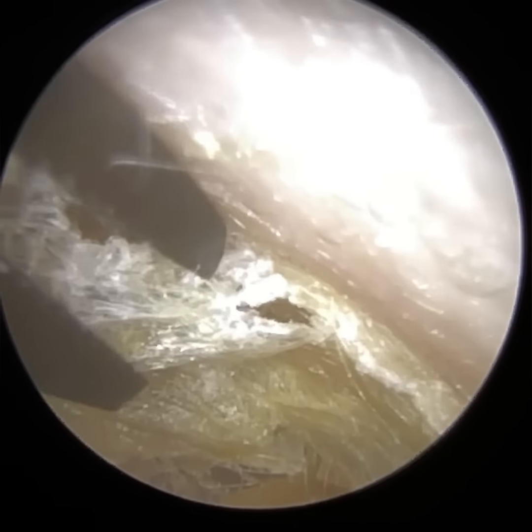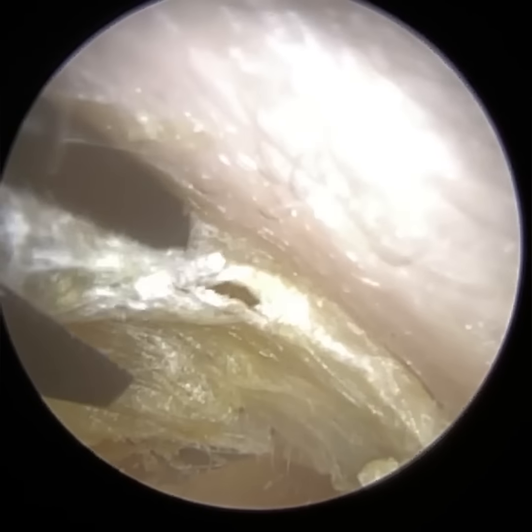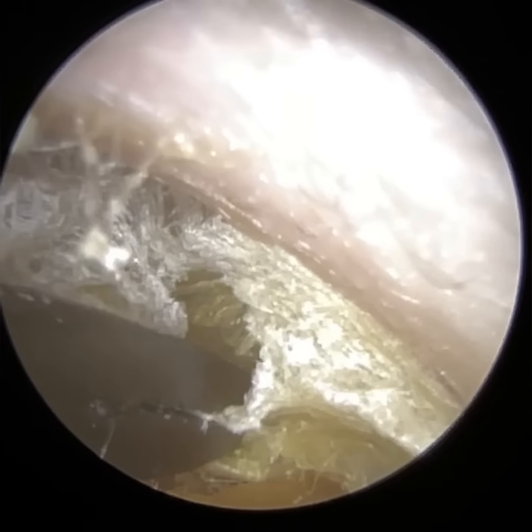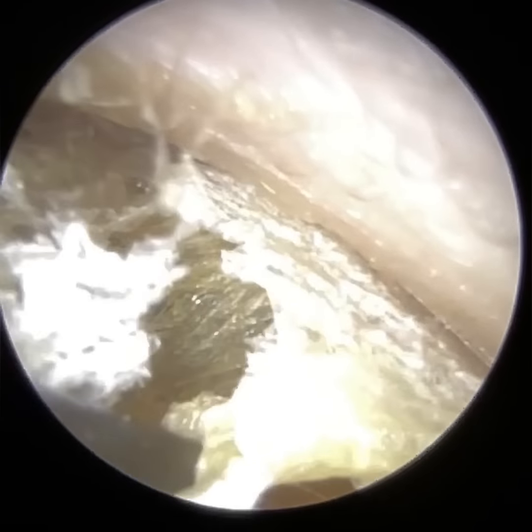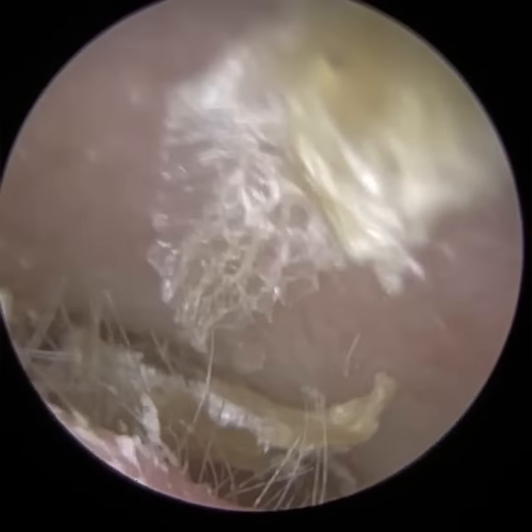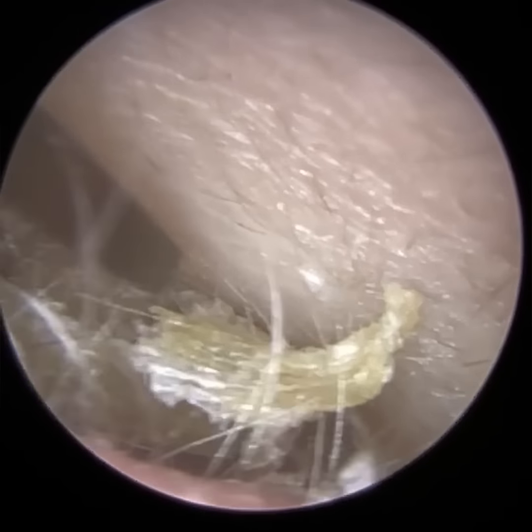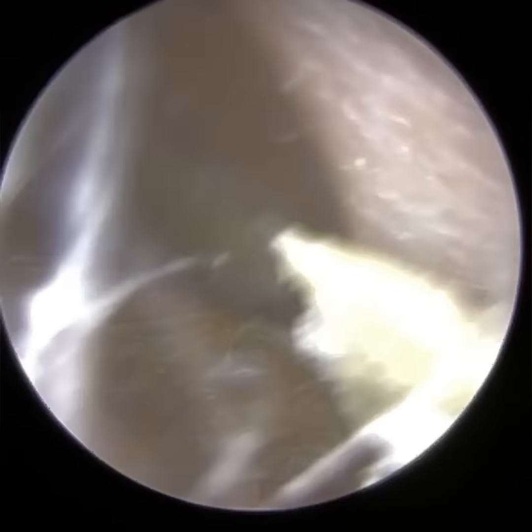It was the first time I've seen a double perforation. And I'm sure it was this patient, and at that time their middle ear was infected and they had 2 perforations. But since then, being quite an elderly patient, the perforations never healed, but instead those 2 individual perforations, which were adjacent to one another, became one large perforation, and that's the result of it now. And this patient obviously has seen ENT, and they were advised against surgery.